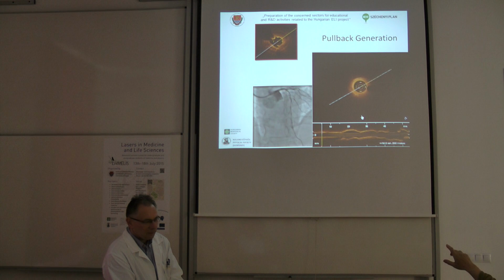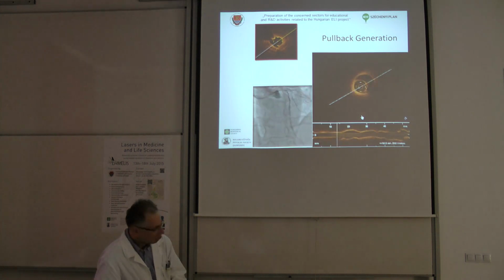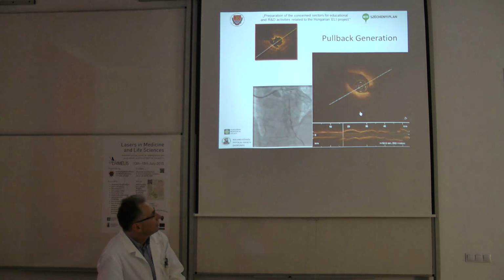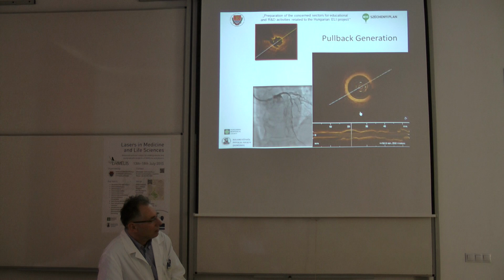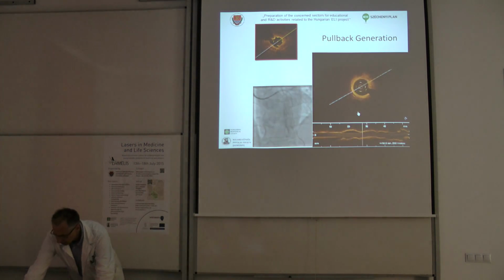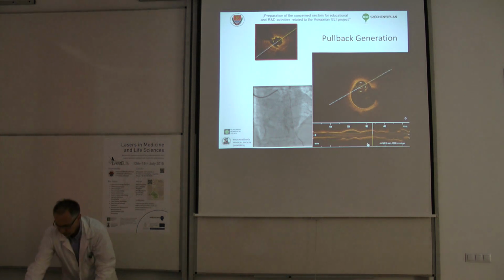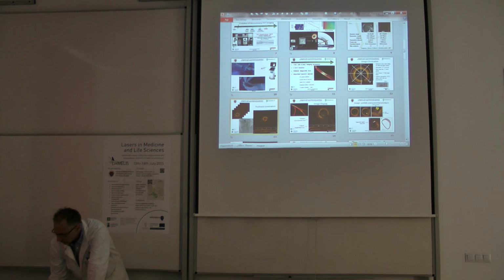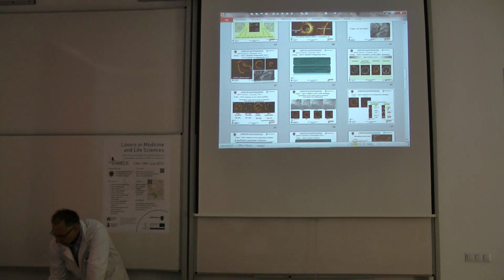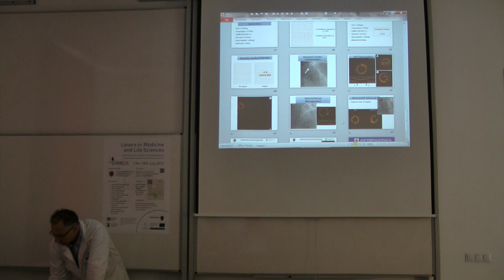You don't have here an image showing the situation when blood penetrated and you cannot see. I was curious to see how that looks. Before you flushed it, how much could you see of the tissue if that is filled up? Let me see, maybe I have this image. Everyone speaks about the rate of imaging, but that is given without the time taken by the flush, which sometimes may take considerable time. Yes, sometimes 5, 6 seconds.